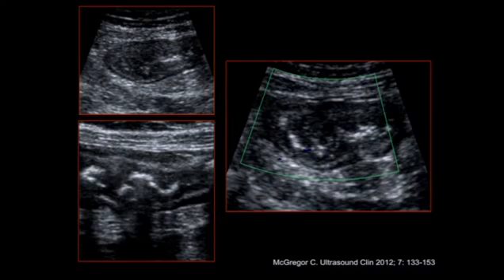And this was an elderly man post-total knee replacement. When we came to ultrasound, he was able to localize his pain for us, and we recognized that his right colon was extremely thickened. In addition, when we put Doppler on, despite the marked bowel wall thickening, we were unable to obtain any Doppler flow despite maximizing our flow for sensitivity. So we were able to suggest the diagnosis of ischemia. We weren't obviously completely confident on ultrasound, and I'm not suggesting that we would be. However, we were suspicious enough to send this patient to a CT scan to optimize his creatinine and to give him contrast, and he did indeed have right-sided ischemic colitis and was sent to the operating room, and this was path proven.